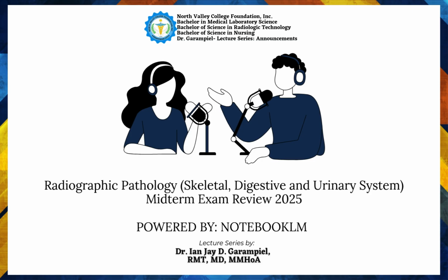If a patient has ascites, extra fluid in the abdomen, what does the radiographer have to adjust? They have to increase the kilovolt peak, the kVp. Water is much denser than, say, gas or normal soft tissue. Makes sense. So if you increase the fluid content in the body part you're imaging, you have to increase the power to penetrate it adequately. Otherwise, the structures behind all that fluid will look washed out, or you might not see them at all.